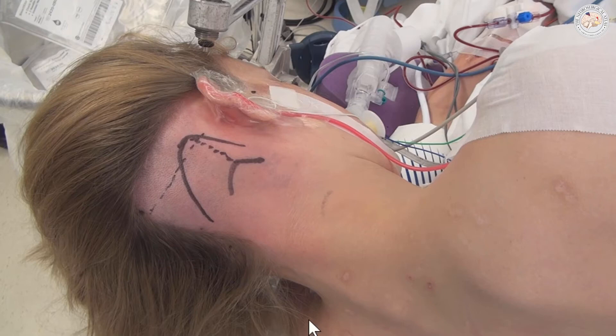In this patient, as you can see, tape has been placed over the shoulder of the patient and the shoulder has been gently retracted anteriorly and caudally.